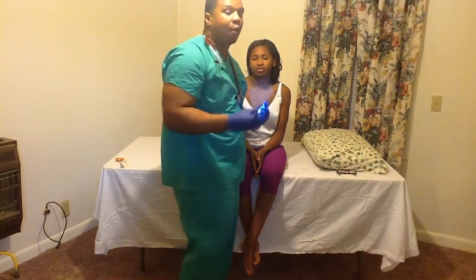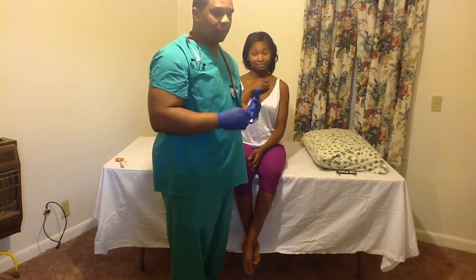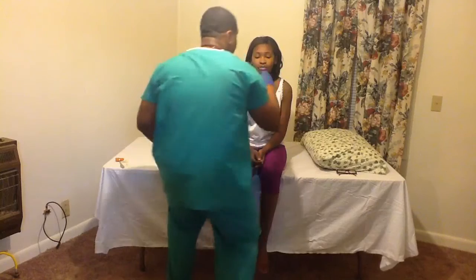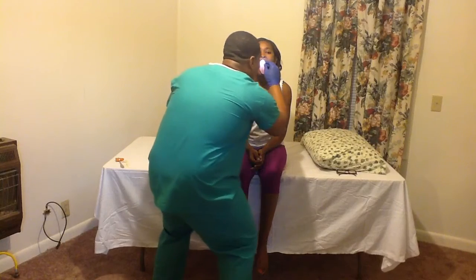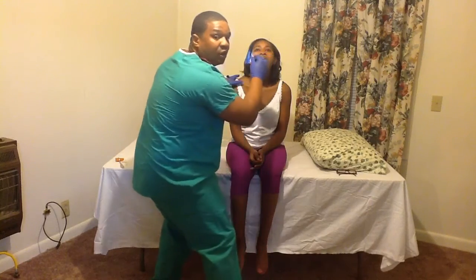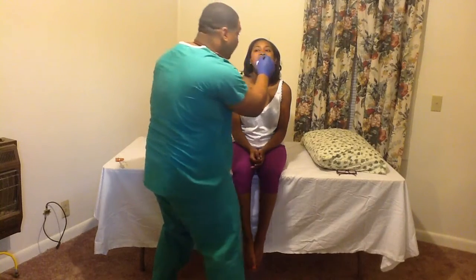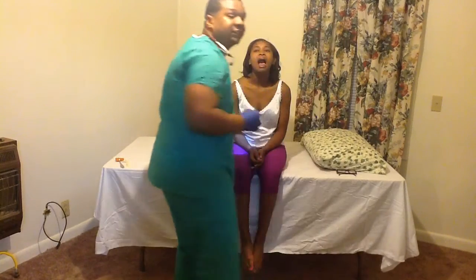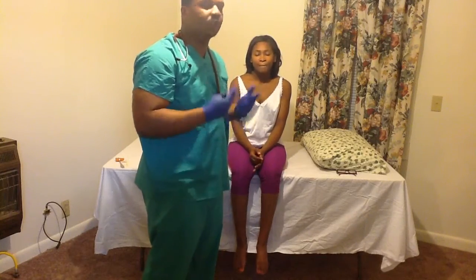While inspecting the mouth, I will make sure my client has a gag reflex, the teeth are intact, and the membrane of the mouth is pink and moist. I'm going to use my penlight. As my client opens her mouth, the tonsils are removed. You have no tonsils. The teeth are intact, no cavities or decay. The mucosa is pink. The pharynx and larynx are normal without any lesions on them.